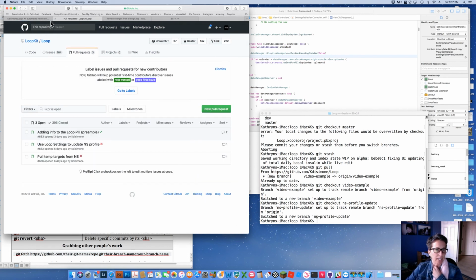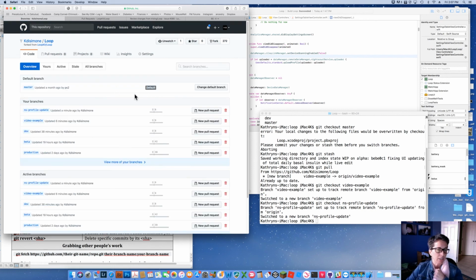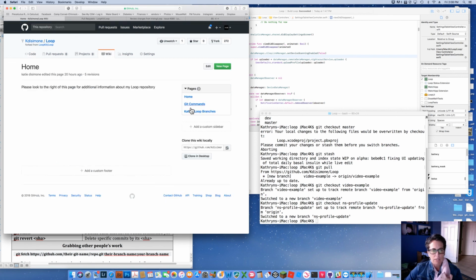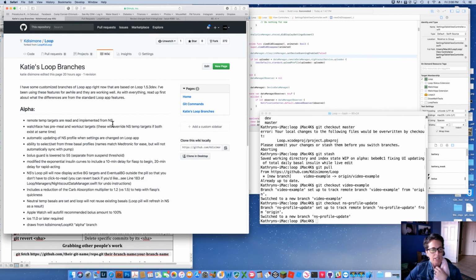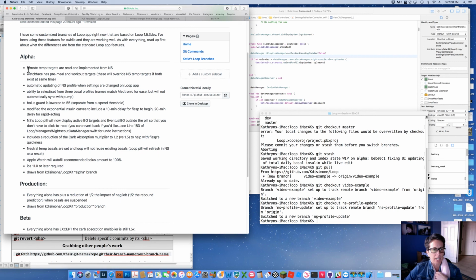So getting back to that, I have some customizations that I really liked, and I put them all together into a branch that I build with now. I don't build with a standard branch, I'm building with a customized branch. And I'll tell you, my customized branch that I'm using is called Alpha. That's what I'm using, and only because I'm doing this video, I'll explain to you what some of my branches are.